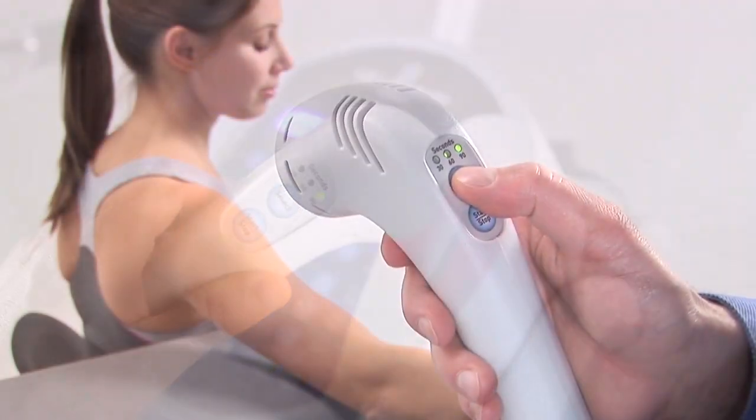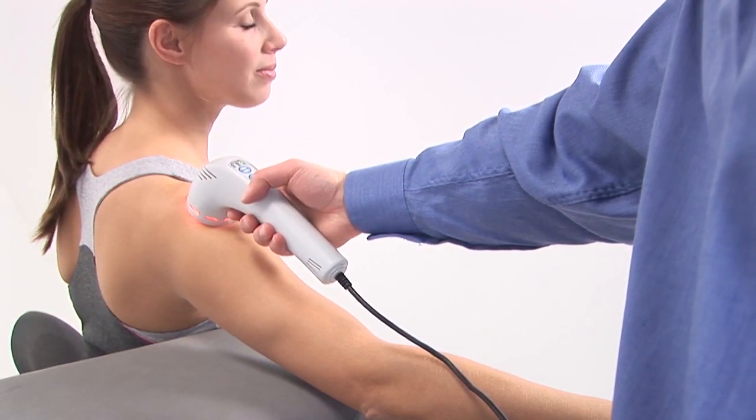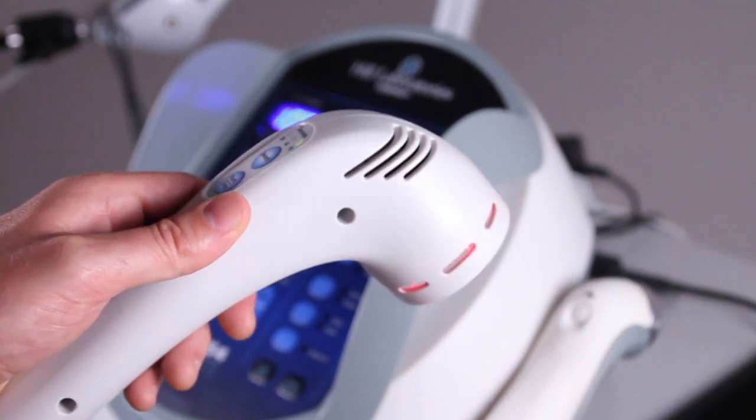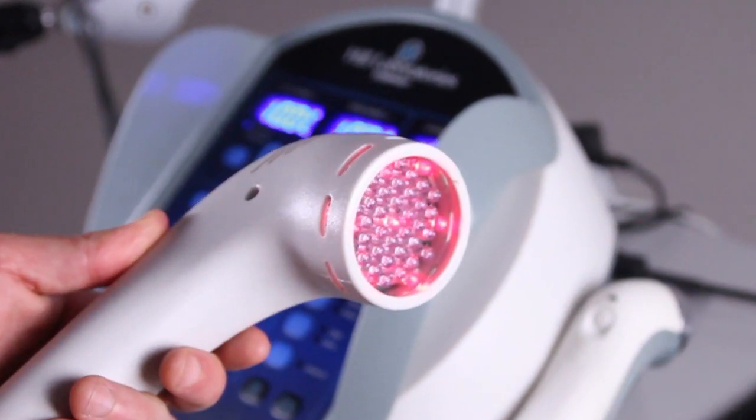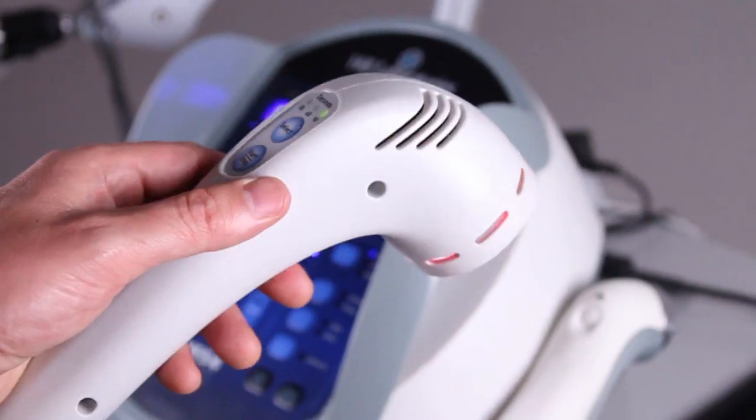The light head comes with three time settings and should be placed directly on the skin. The Horizon's infrared light has been proven to absorb into the body's cells, transforming that energy into adenosine triphosphate, the form of energy that cells utilize for healing.